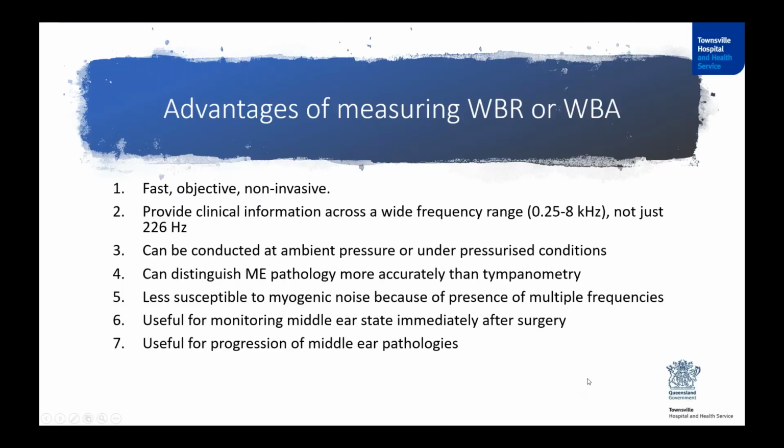In summary, the advantages of measuring wideband absorbance are that it's a fast and non-invasive test and provides information across a wide range of frequencies, not just at one particular frequency. It can be conducted at ambient or pressurized condition. Because it can be done under ambient pressure, we can do it immediately after surgery. There's really no harm in doing that, because we can do OAE as well as the ambient pressure measurement.